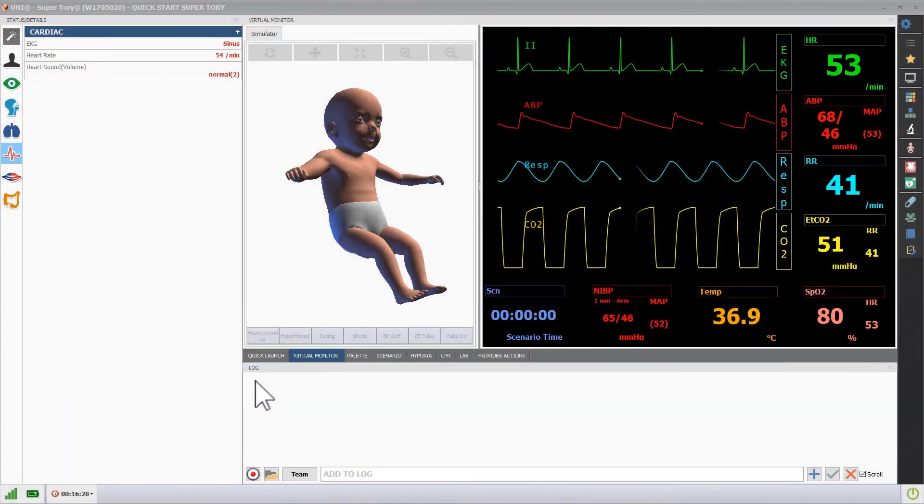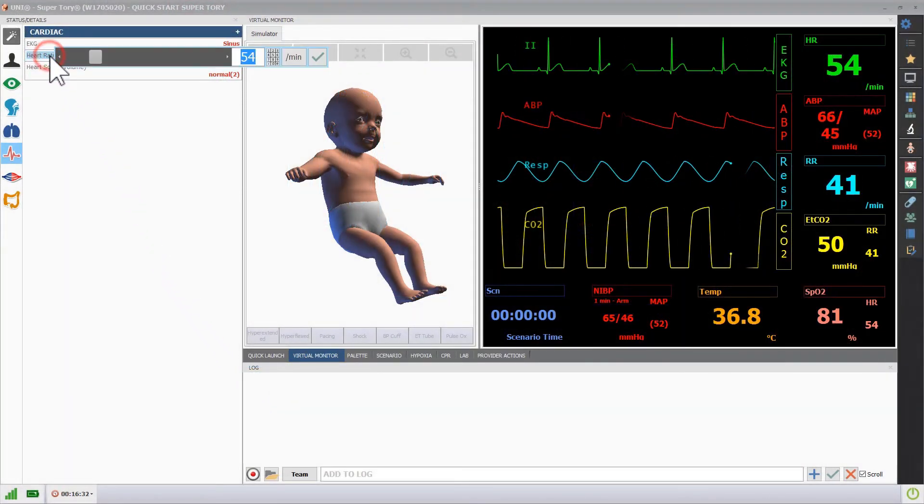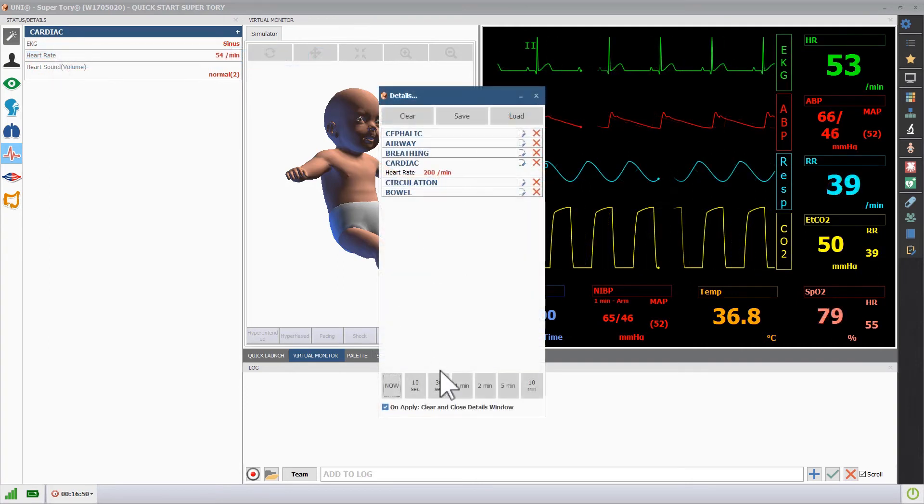By turning off the instant apply feature in the upper left, you can trend a change to the heart rate by choosing the transition time.